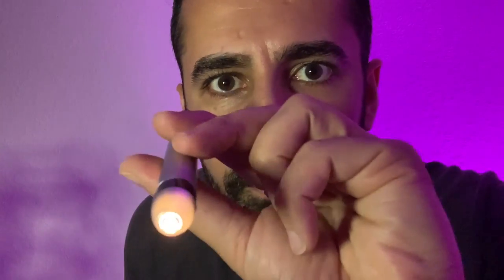You have certainly had your pupils checked when you've been to see your optometrist or ophthalmologist. We have this pentorch. As you're looking straight into the distance at the wall, we're checking your pupils — something you've seen many times on the channel. Follow the light, keeping your head still, and report any double vision of the light. This is your oculomotility test. Looking straight ahead again for a quick look at the pupils, and then we can do the swinging flashlight test. That is the pentorch.